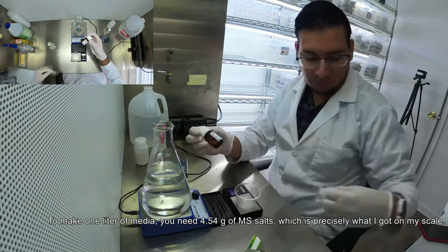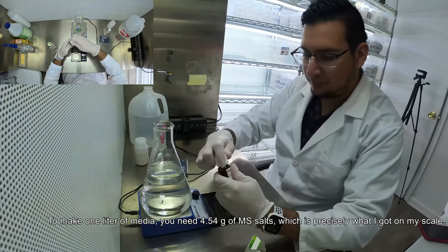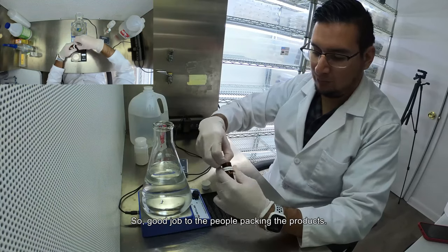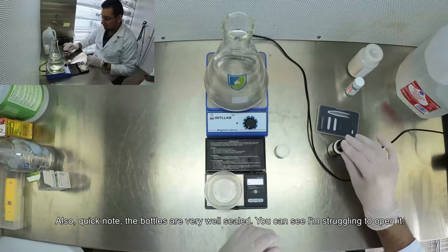To make one liter of media you need 4.54 grams of MS salts, which is precisely what I got on my scale — so good job to the people packing the products. Also a quick note: the bottles are very well sealed, as you can see I'm struggling to open it.